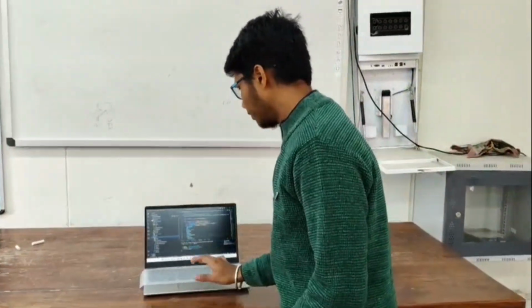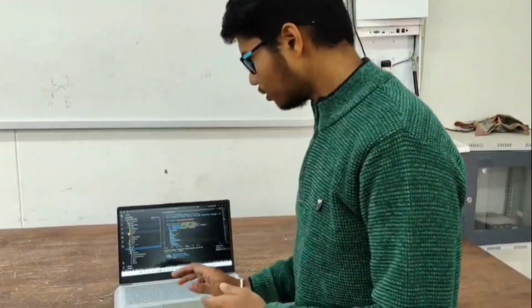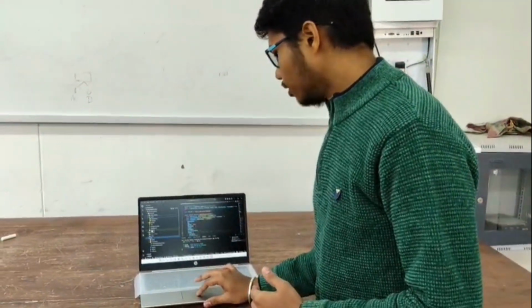The first one includes the backend. The backend includes all the node modules, the node packages which we require in this project. The second one is the routes, which contains the ambulance.js routes and the doctor.js routes. The ambulance.js routes include adding the patients, and the doctor.js routes include fetching the patients from the database and injecting the medicine. The service folder, I will talk about it later. The server.js combines the ambulance.js and the doctor.js.